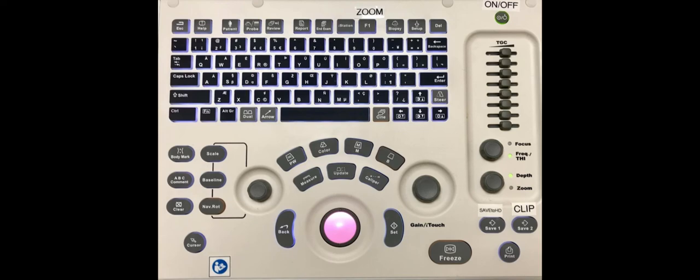Below the TGC slider are the focus, frequency, depth, and zoom knobs. Simply press each button to select either focus or frequency, or depth or zoom, and then turn the knob to change the specific setting. For most novice users, the main knobs and buttons used will be the depth control knob, the gain control knob, and the freeze function button.